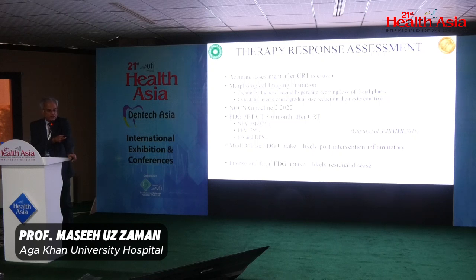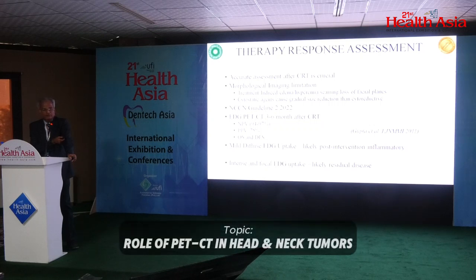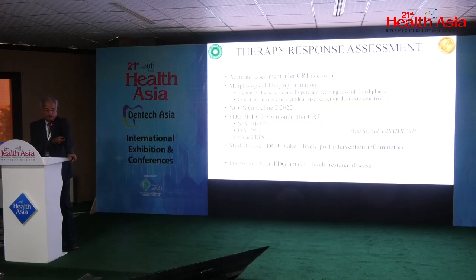However, certain cytostatic agents which have been introduced nowadays cause a reduction in size in a gradual manner from 6 weeks to 6 months' time. Therefore, the precise response assessment is usually delayed if you use CT and MRI, which is not possible for the precise management of the disease.